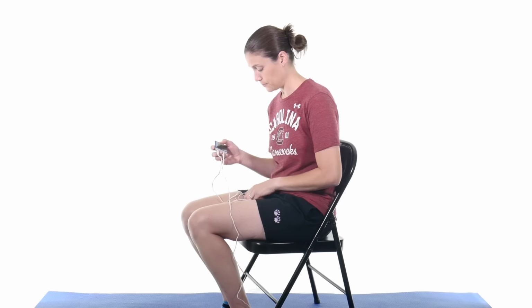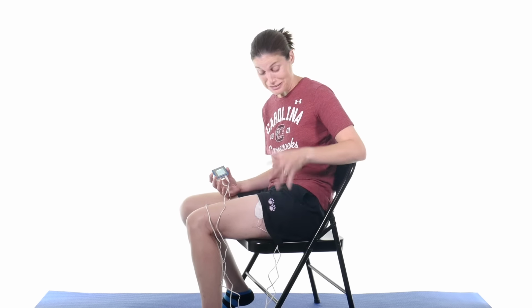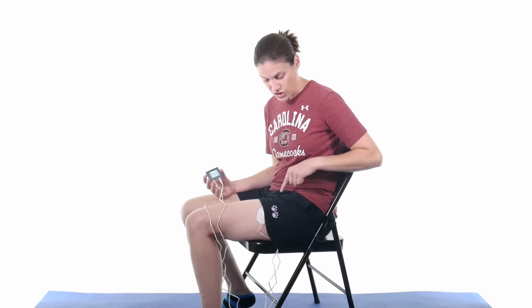So I'm going to put these on and then I'll go into a little more detail about what to do with this. So I've got them placed now, and I just put my shorts back down because I didn't want to blind you with my milky white thighs. But what I have is, for channel 1, it's here and here. That's where the electrode is. And for channel 2, it's here and here. So I'm placing the electrodes as if I had that hip bursitis, or that greater trochanteric bursitis.